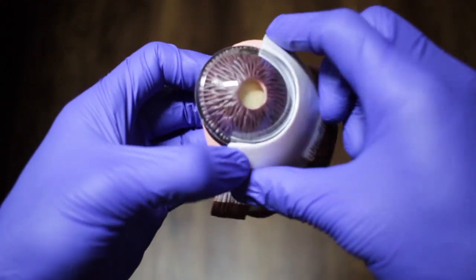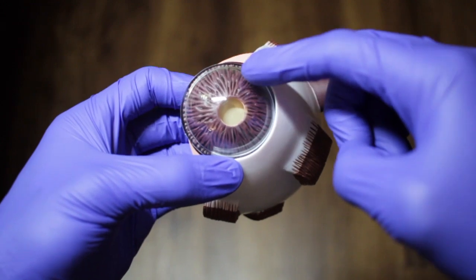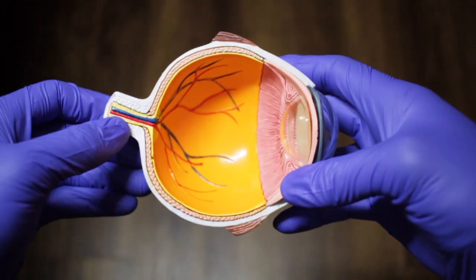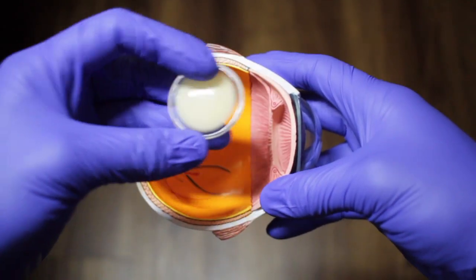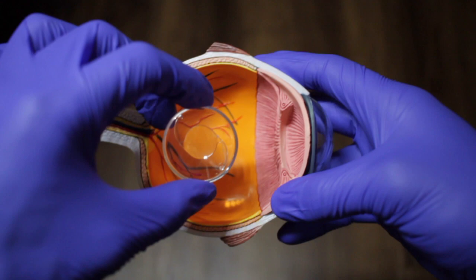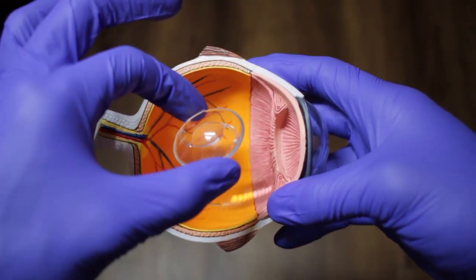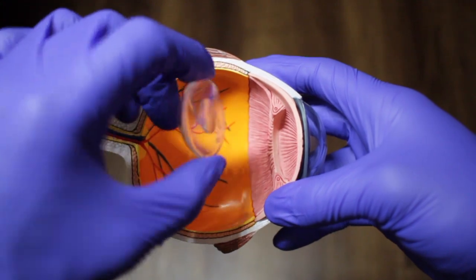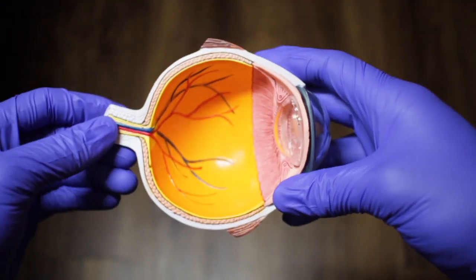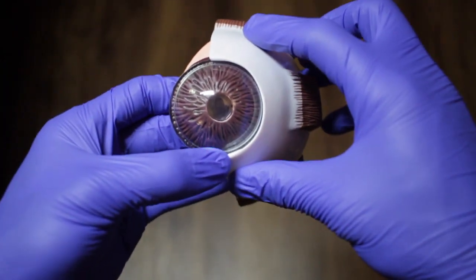In cataract surgery, we make a very small incision in the front part of your eye, the cornea, just a couple of millimeters. We break apart the cataract, your lens, and remove it from the eye. In its place, we put in a clear acrylic lens to help to focus the light for you. This will improve your vision by making what you're seeing more clear, with better contrast, more vibrant colors, and help to resolve the glare and halos that you're seeing.